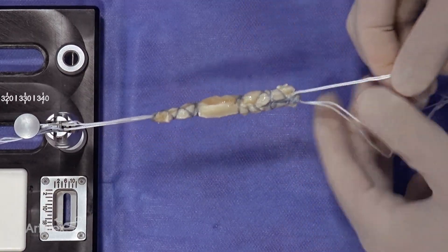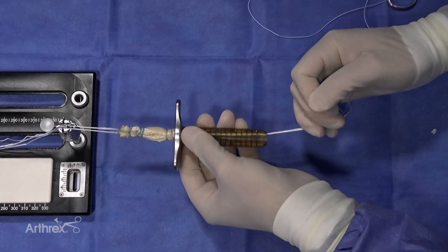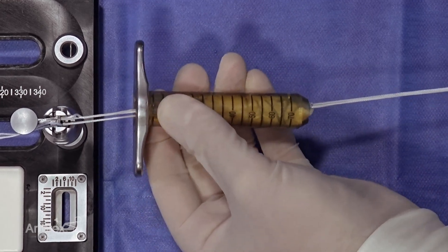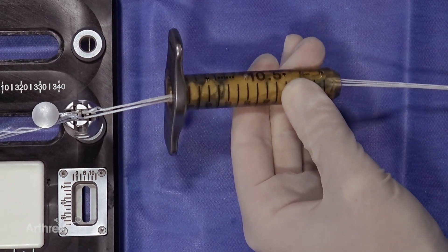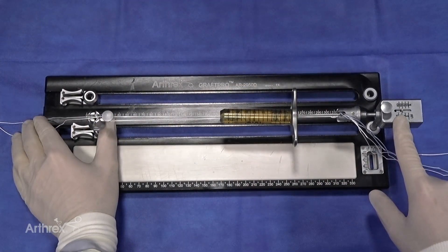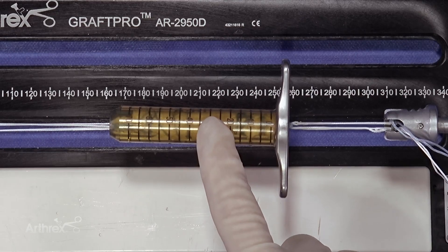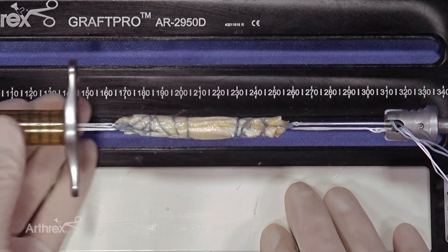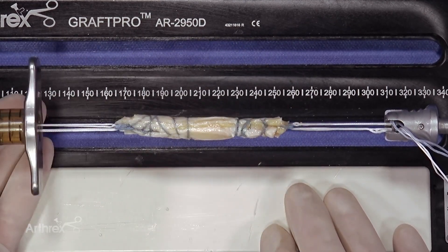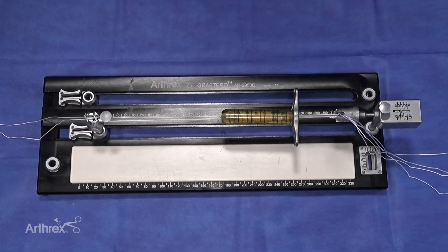Quad grafts tend to be rectangular in shape. We use the graft compression tubes to take the rectangular quad graft and make it circumferential, so we tubularize it. This makes it very easy to pass into the tunnels we created with round drills. You can see we can size the graft as well. We can see both distance and the circumferential measurement. Now this graft is ready to place.